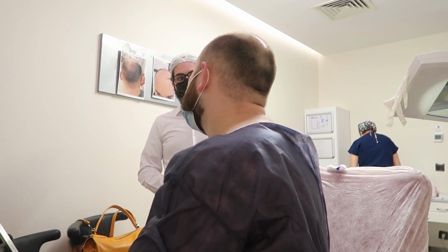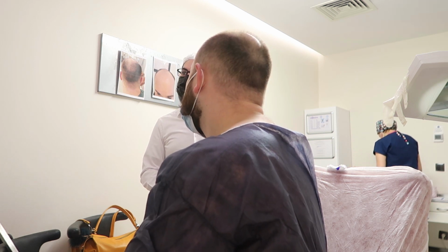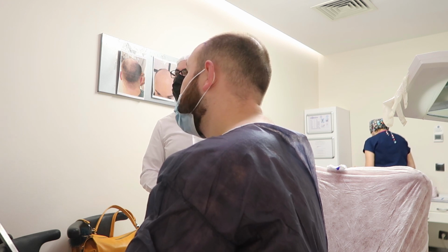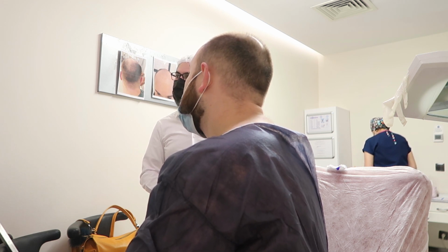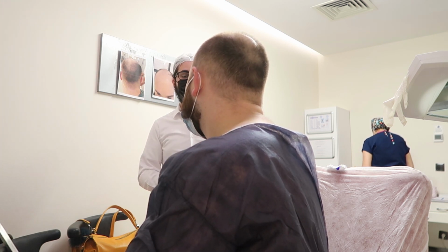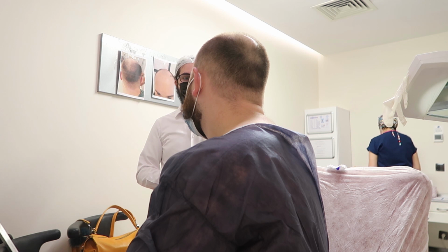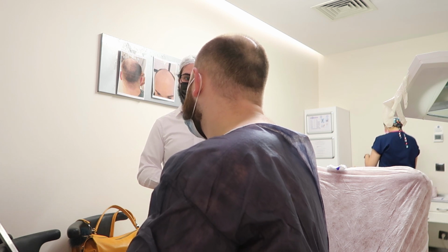And if he needs to, can he take some from here, from the beard, or no? He said that the most important and the most perfect donor area will be from the back of your head, but if you take from your beard, it's not that bad. So it's gonna be a little bit of a problem because the beard here is different from the back of your head.